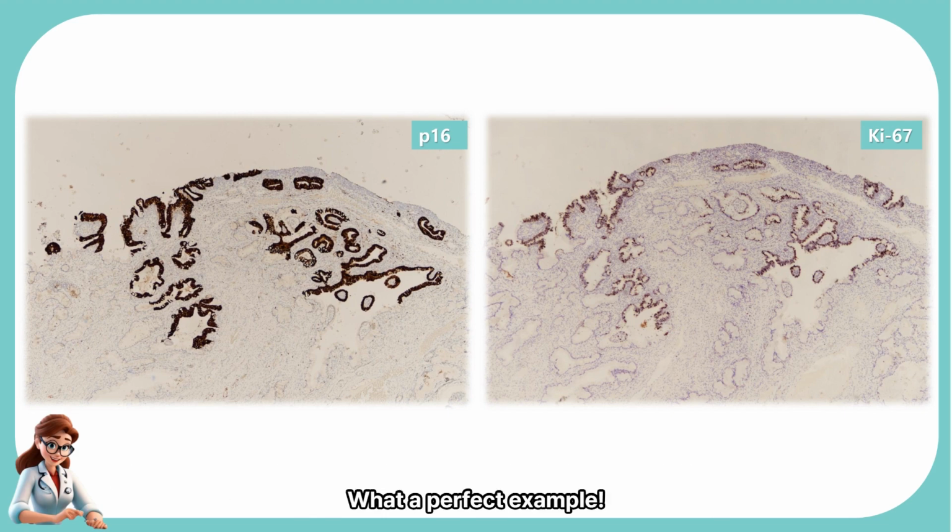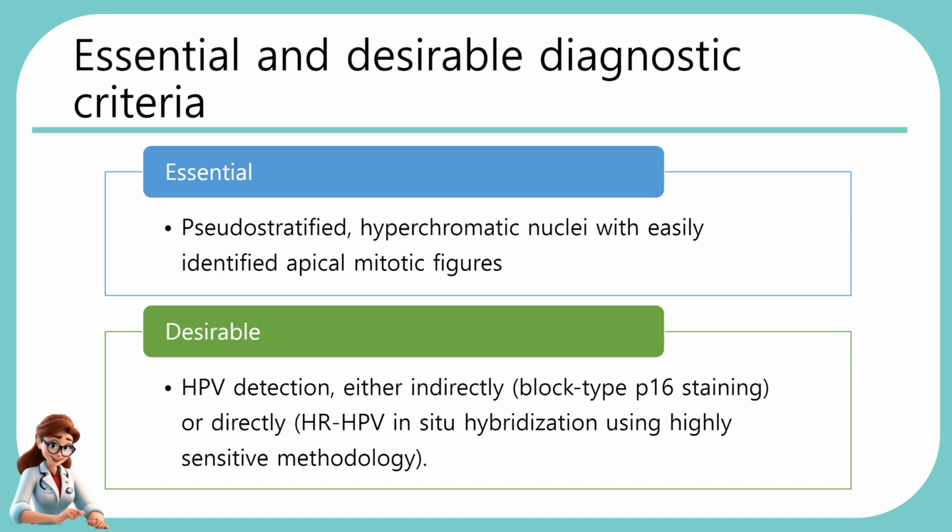What a perfect example. Before we wrap up, take one last look at the essential and desirable diagnostic criteria. Pause for a moment if you need.